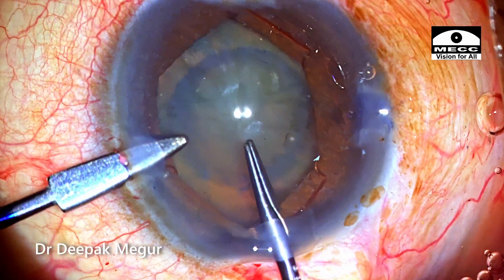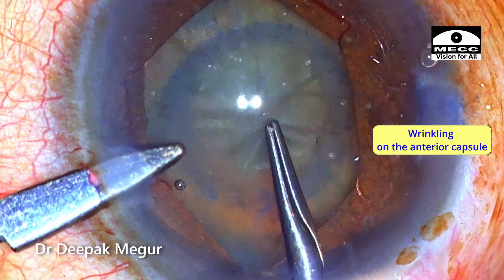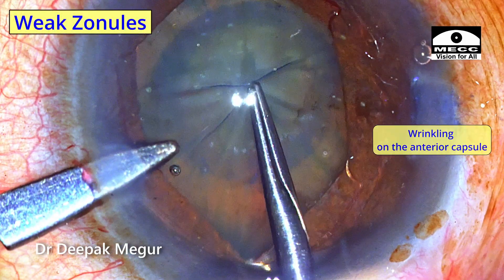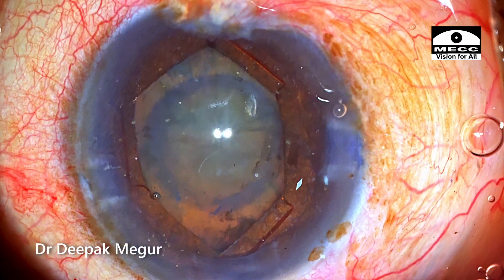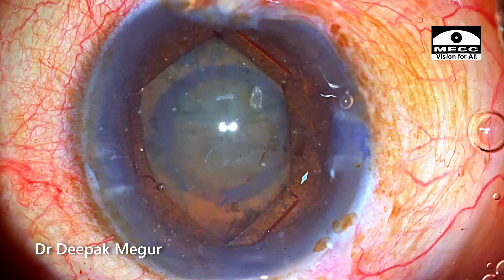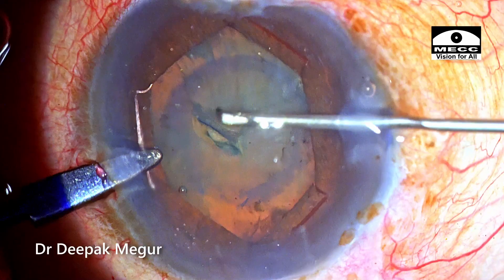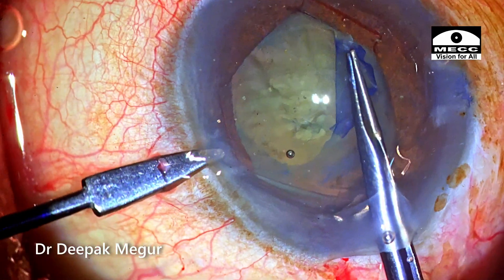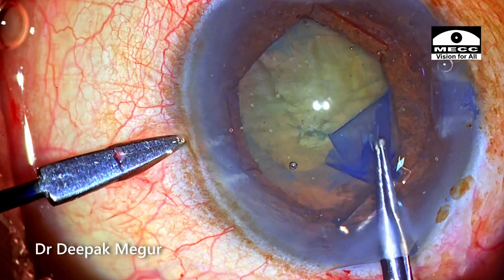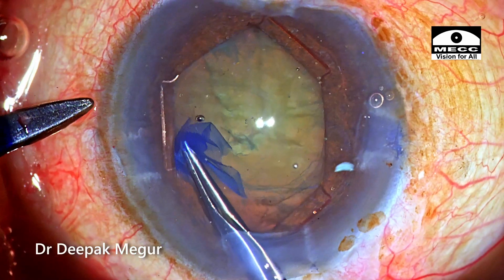As I try to puncture the capsule with the forceps, I can see the wrinkling of the anterior capsule and its refusal to tear or puncture with the slightly blunt-tipped forceps. This is evidence that the zonules are not very healthy. I go back with my sharp 26-gauge needle, which punctures the capsule quite easily. The rhexis is completed using the forceps, and a decent-sized 5 mm rhexis is achieved quite well.